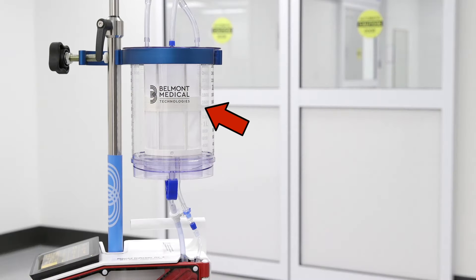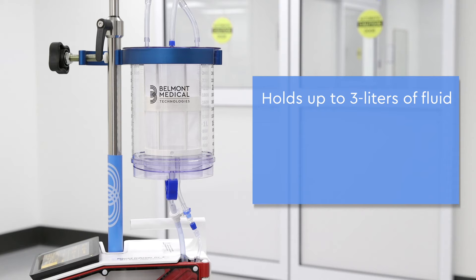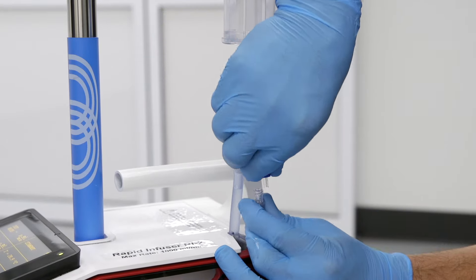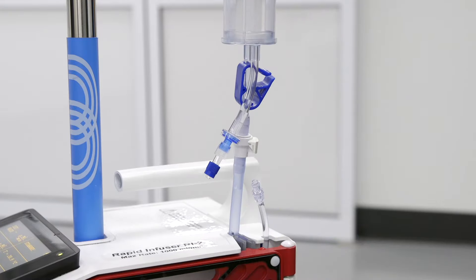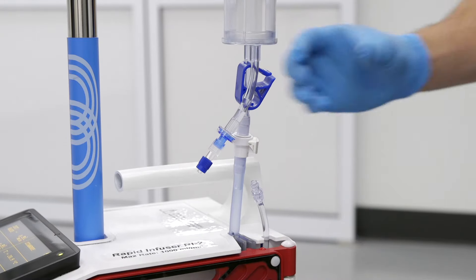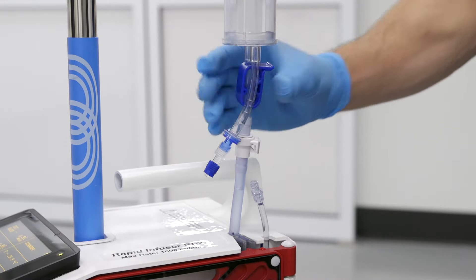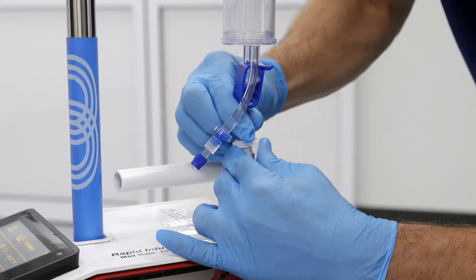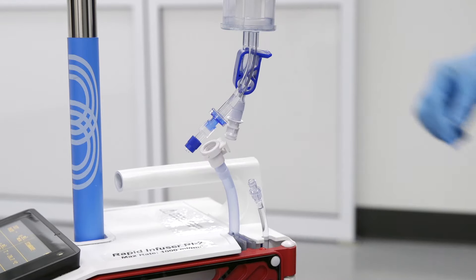The optional large volume reservoir can be added at the beginning or anytime during a procedure. The LVR will hold up to 3 liters of fluid, has 5 fluid spikes, and can be added to the system in less than 1 minute. Disconnect the small reservoir by unscrewing the lure fitting on the recirculation line. If the small reservoir contains fluid, close the blue clamp to prevent a spill before disconnecting the fluid line.